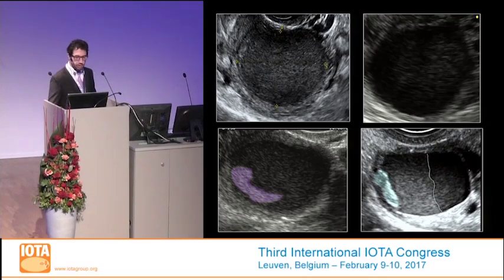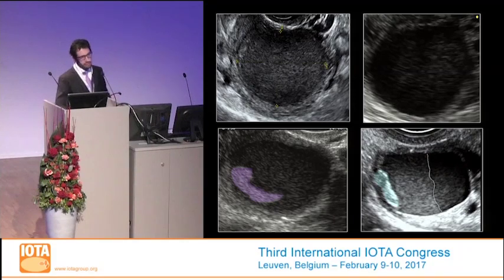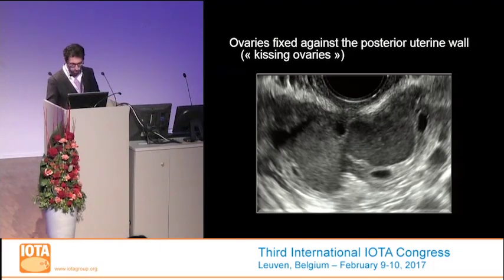And these are so typical that even the echogenic projections or portions of the cystic content are almost pathognomonic, smooth and hyperechoic. These are very typical of endometriotic cysts. Sometimes they can resemble a multilocular cyst, but it is clear that they can produce adhesions, they can be adherent one to the other, and this is a typical case of so-called kissing ovaries. These are in reality two different endometriotic cysts and not one.